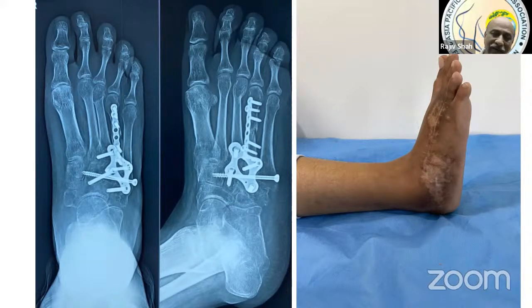Like in calcaneus, we are building our reduction onto the medial sustentacular fragment. And the first thing we do is make sure that fragment is in position. Like for a Lisfranc injury, we are trying to build our reduction onto the cuneiform. So the cuneiform itself must be stable. If it is not stable, then you have to make it stable. So whenever you're doing Lisfranc surgery, the first thing you will put in would be an intercuneiform screw if it is unstable. And then you build your reduction over it.